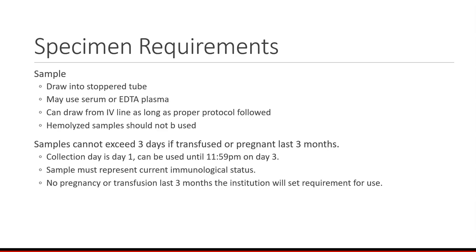What they're supposed to do is stop the IV, allow the blood to go for about 10 minutes, draw the sample, and then turn the IV back on. But most nurses say, yeah, I can't, I have a 50-50 chance that my IV won't clot off when I do this. So it's preferable to just draw from the opposite arm or draw below the IV.